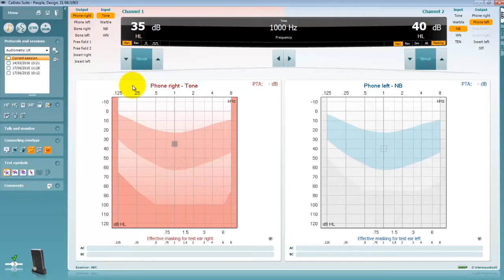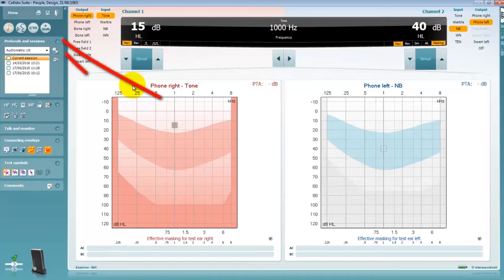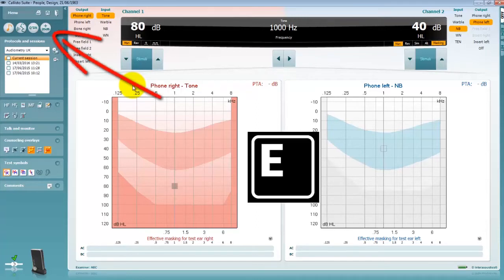To extend your testing range for intensities higher than 100 decibels you can click on the extended range icon or press the E shortcut key.